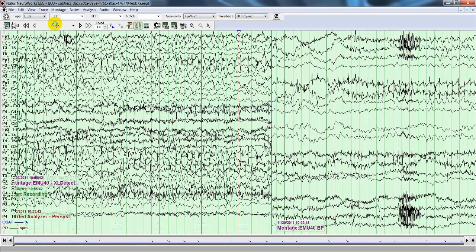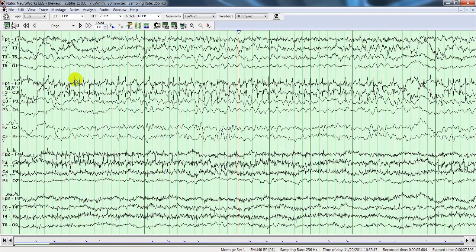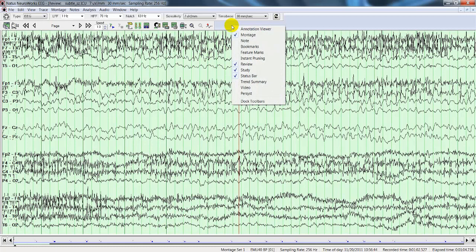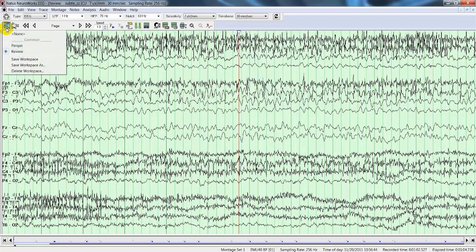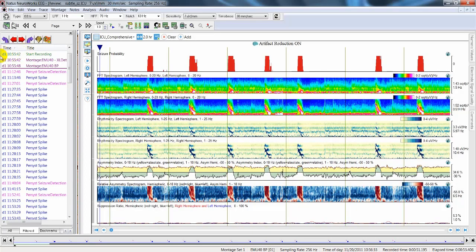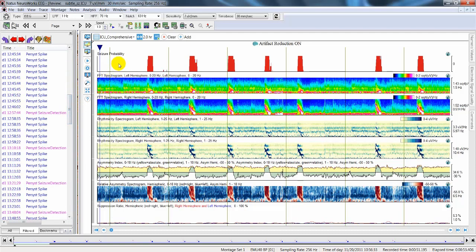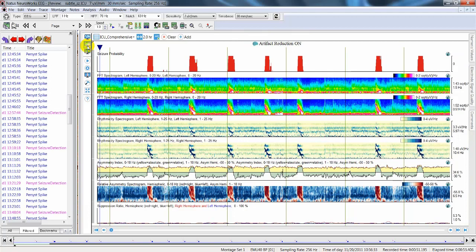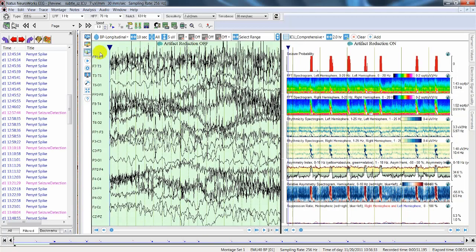The NeuroWorks review screen appears and shows us the recording montage. To open the Persyst view, you can right-click on the main toolbar and select Persyst, or click on the workspace icon on the left side and select the Persyst workspace previously created. The layout is composed of the annotation viewer on the left side where all events are displayed, and the Persyst view where you can choose to display the EEG view, the trend view, or both.